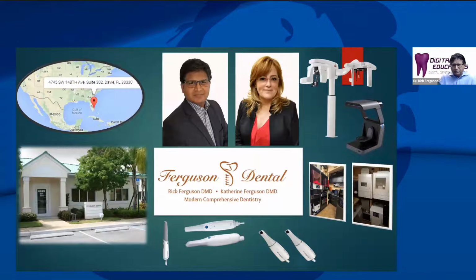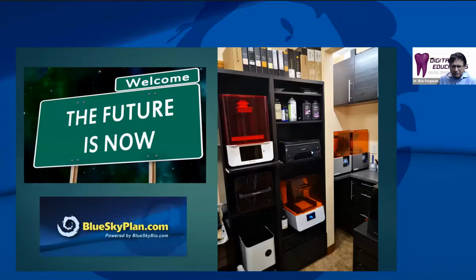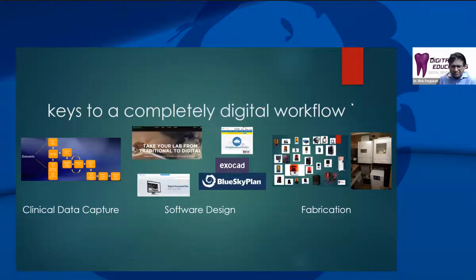That said, we do have a private practice, Dr. Catherine Ferguson and myself, near Fort Lauderdale, Florida. And we have all the technology that we need. We have CBCT, desktop scanners, a variety of 3D printers, a couple of mills, intraoral scanners. We have 5 intraoral scanners now of different brands and so on, some of which I'll talk about. But the future is now in our clinical practice. We are doing these things on a daily basis.